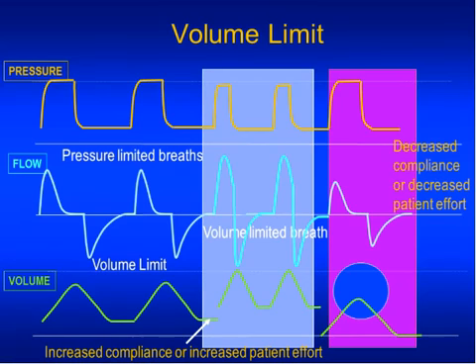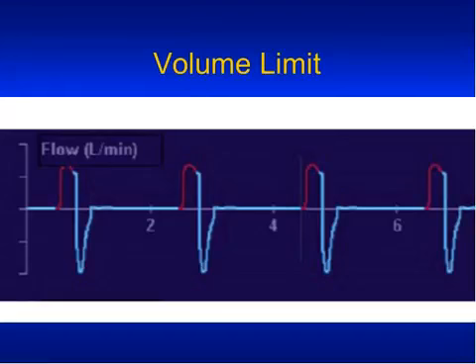So here on the upper panel is your pressure waveform, the middle panel flow, and of course volume on the bottom panel. You're all familiar with these kinds of curves. And as long as the volume does not reach the limit, everything is running as normal. But if for whatever reason the tidal volume now hits the volume limit, inflation will be interrupted at that point, and that can result in very short inspiratory time and a rather awkward type of respiratory pattern that the baby may not be all that crazy about.